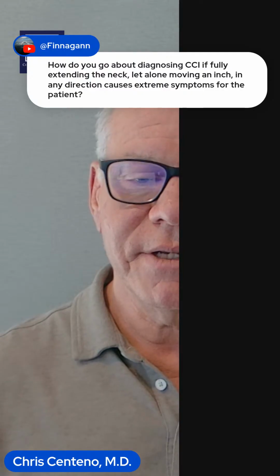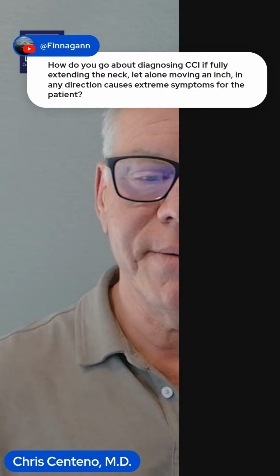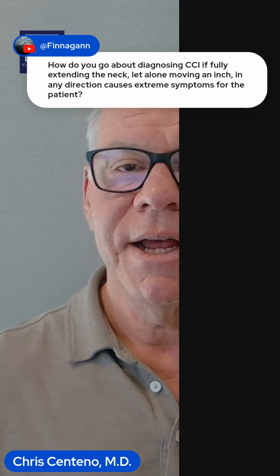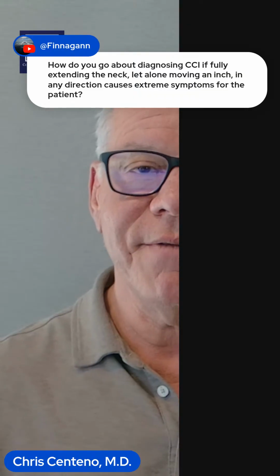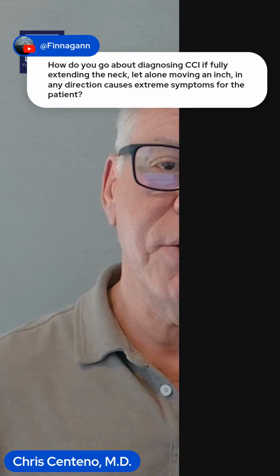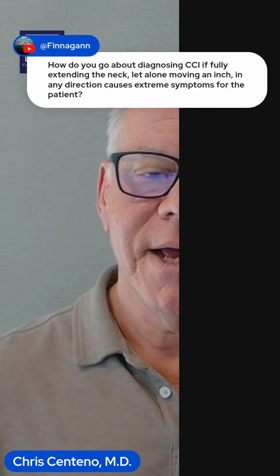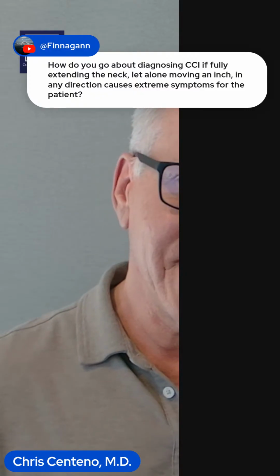Finnegan, how do you go about diagnosing CCI? Fully extending the neck, let alone moving an inch in any direction, causes extreme symptoms for the patient. You may not be able to do movement-based imaging, Finnegan. Now, obviously, now that we have DMX in the clinic, if need be, we could even do IV sedation with the patient. But normally, you can do oral sedation. So you can take some oral Valium to relax the muscles. You can take some oral painkillers to relax the muscles. But you're going to need movement to get CCI diagnosed.